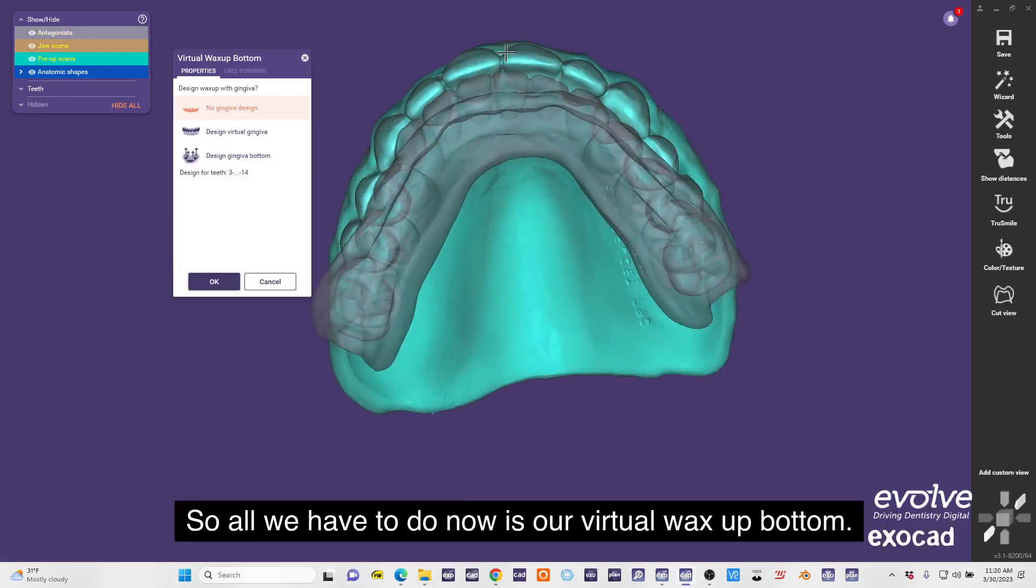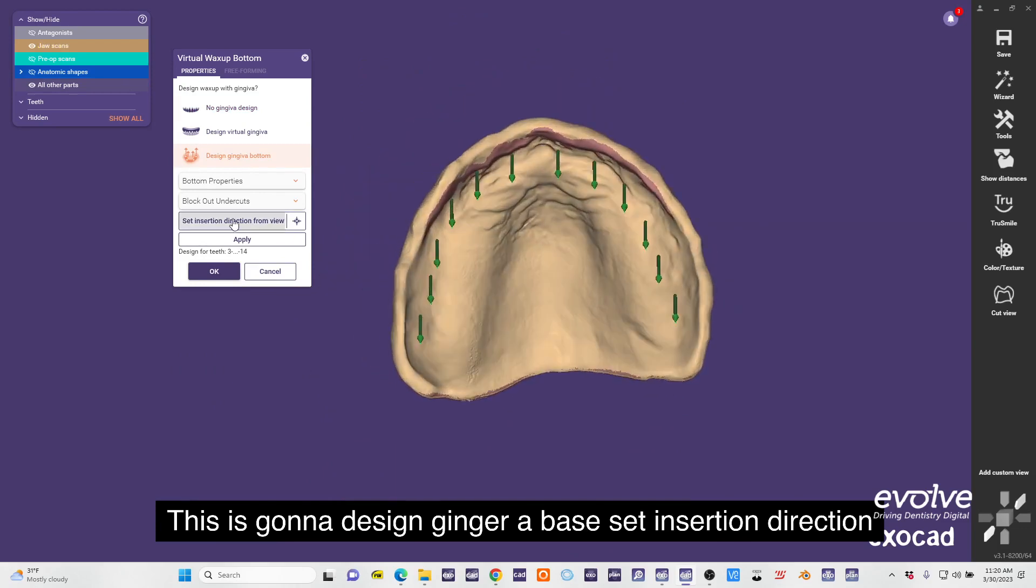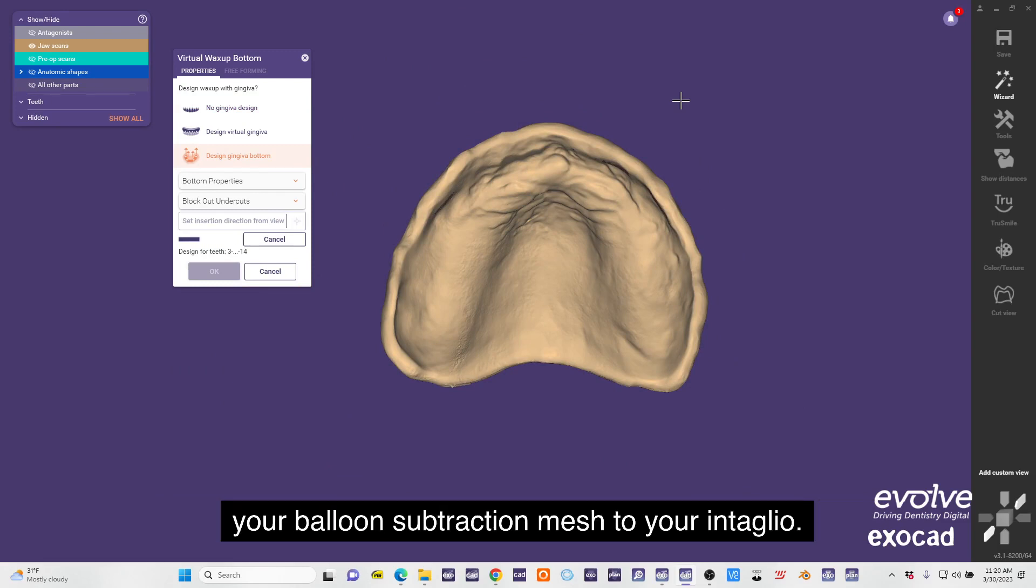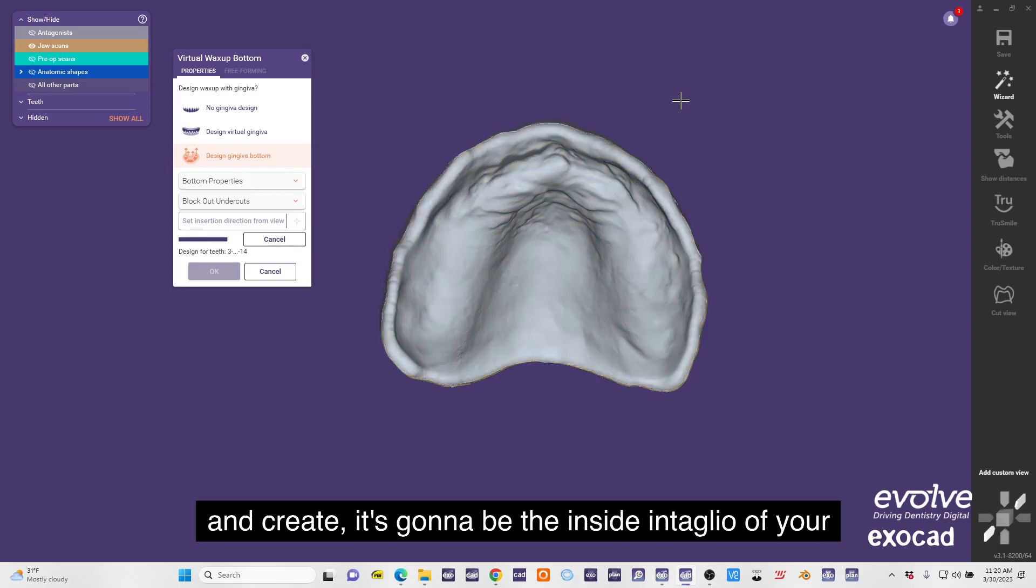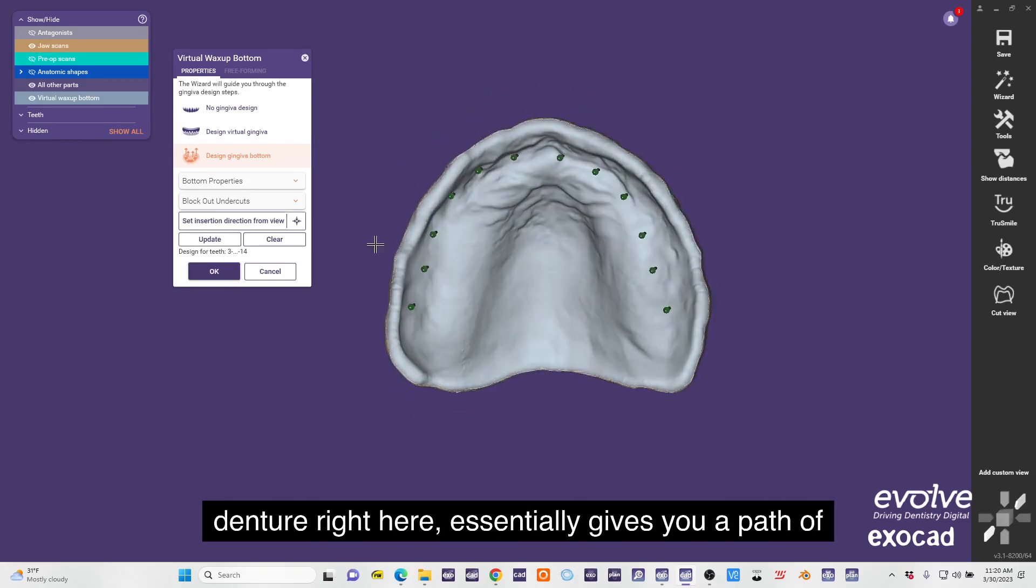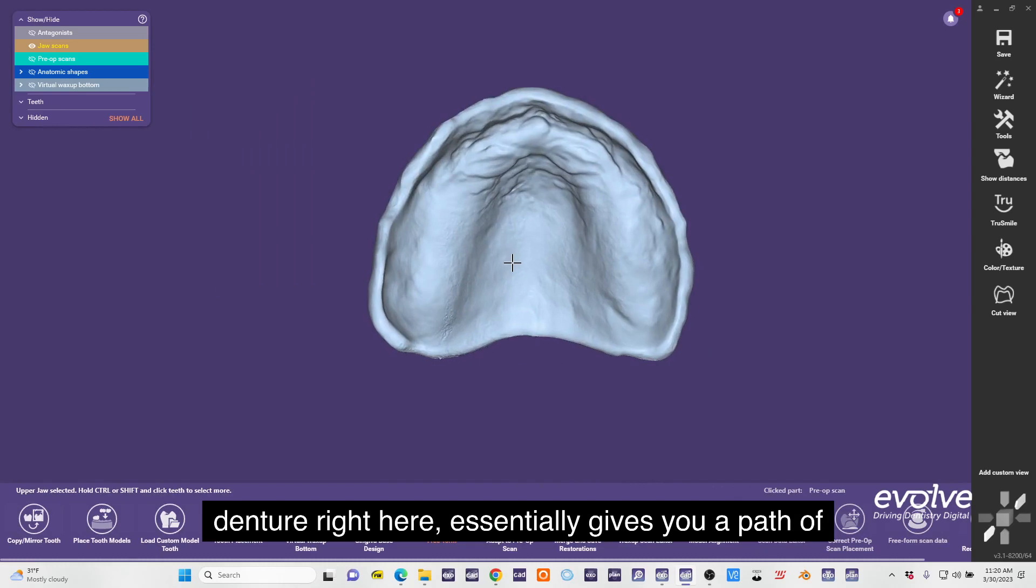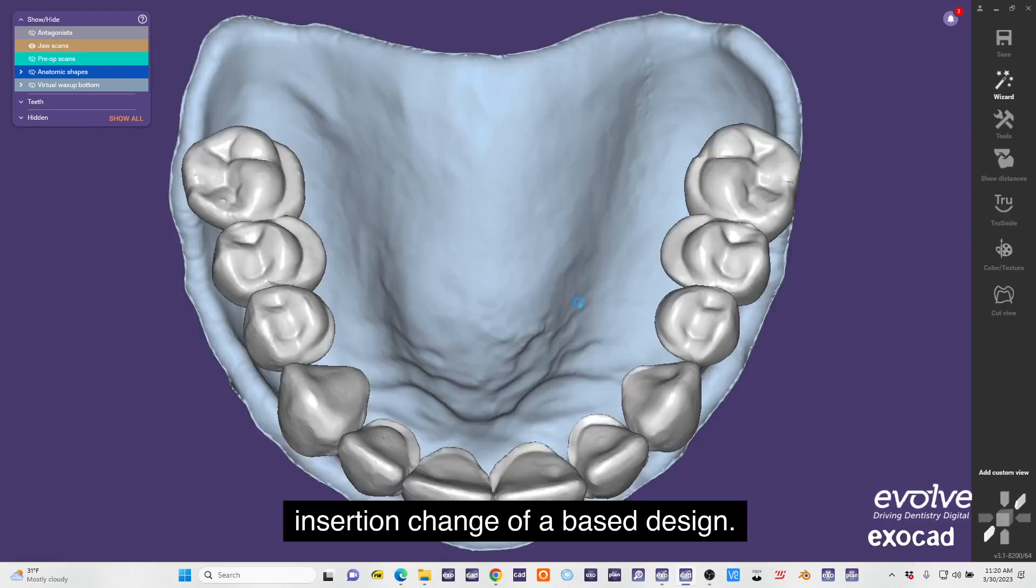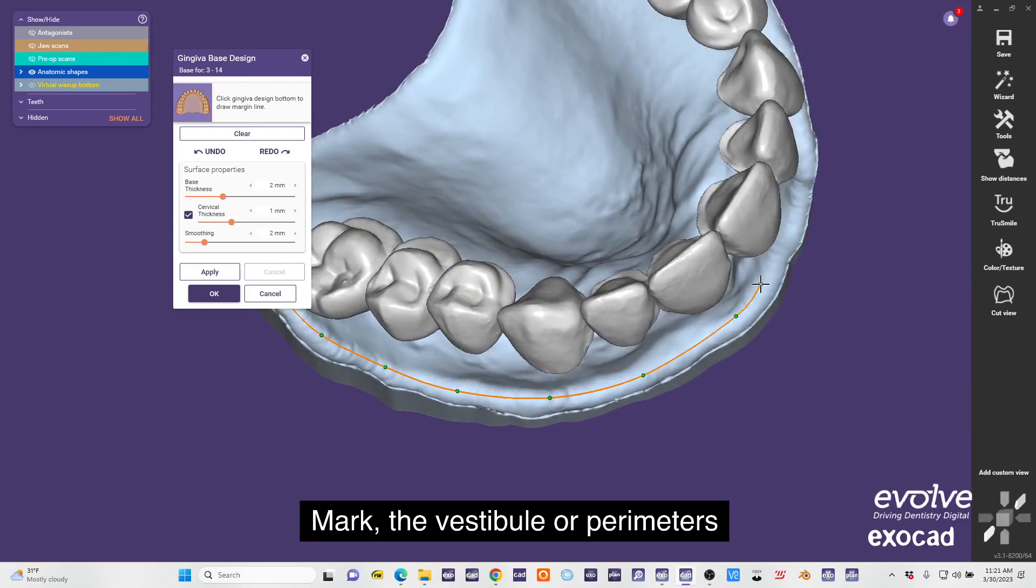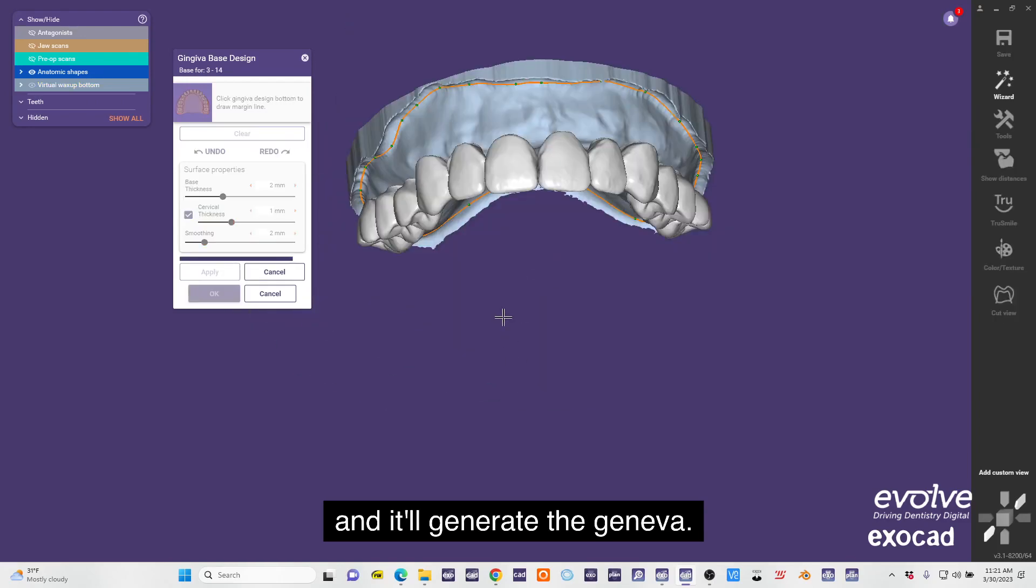All we have to do now is our virtual wax up bottom. This is going to design gingiva base, set insertion direction, and we can apply virtual wax of bottom. This is basically your boolean subtraction mesh to your intaglio - that's what's going to remove from your gingiva design and create the inside intaglio of your denture right here. Essentially gives you a path of insertion, change of base design, mark the vestibule or perimeters, and it'll generate the gingiva.